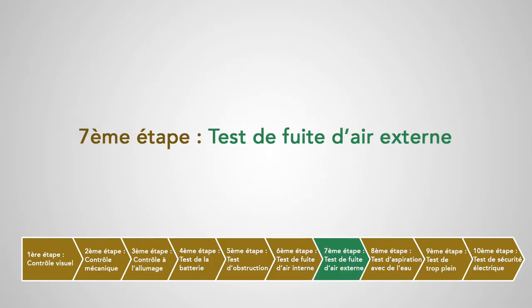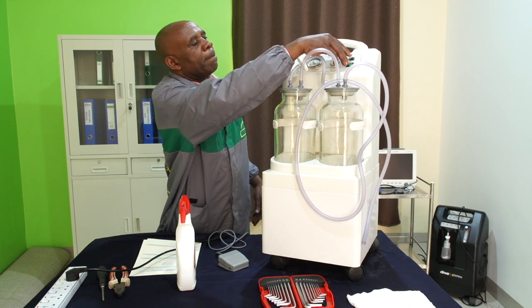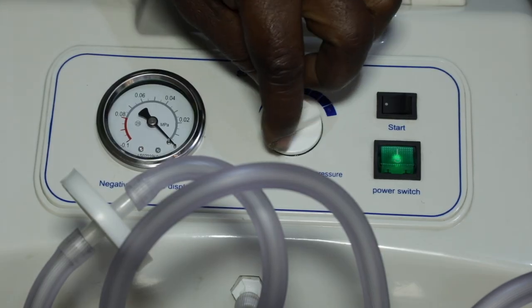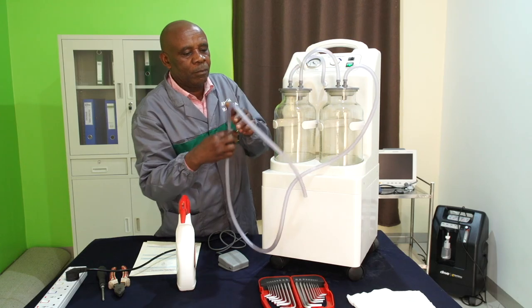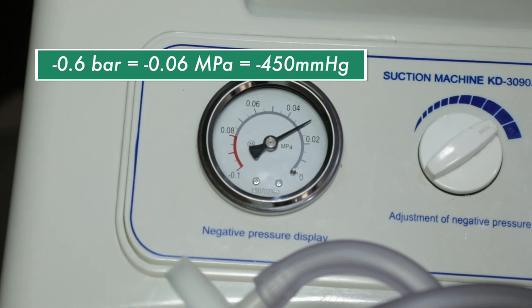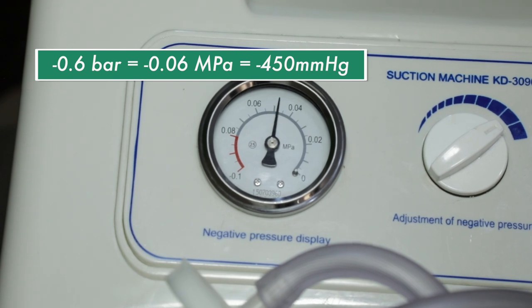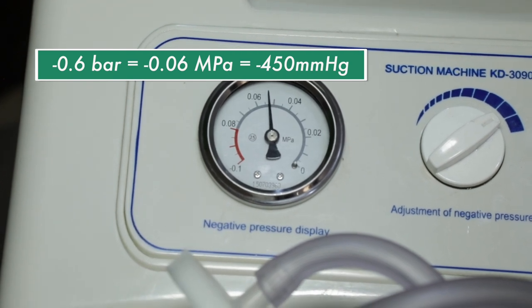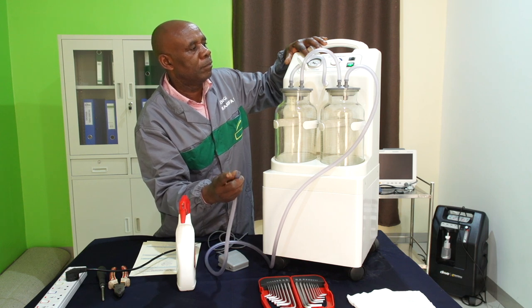Septième étape : test de fuite d'air externe. On va allumer l'appareil et ajuster les boutons de réglage de l'aspiration au maximum. Puis on va boucher les tuyaux patients, c'est-à-dire les tuyaux entre le patient et le bocal, et vérifier le manomètre. Le vide devrait monter en dessous de -0,6 bar ou -450 mm de mercure. Si ce n'est pas le cas, ceci pourrait indiquer une fuite vers le bocal, le tuyau ou le couvercle. Il faut vérifier que le couvercle est bien fermé hermétiquement et que son joint est en bon état.